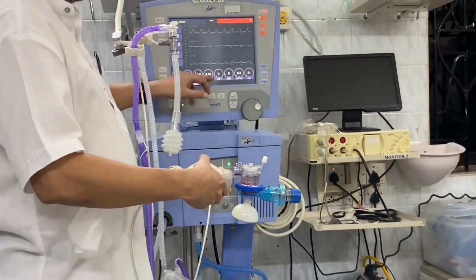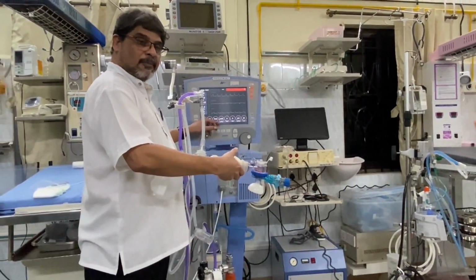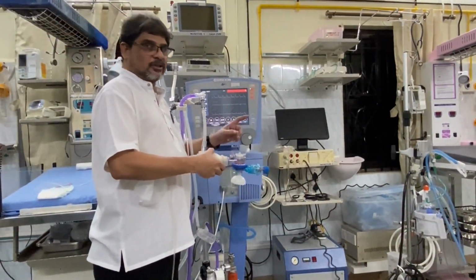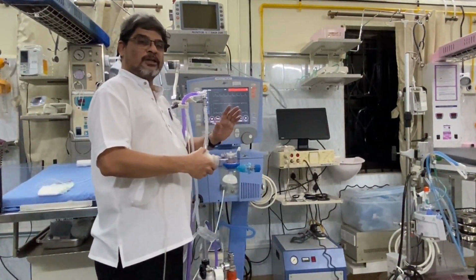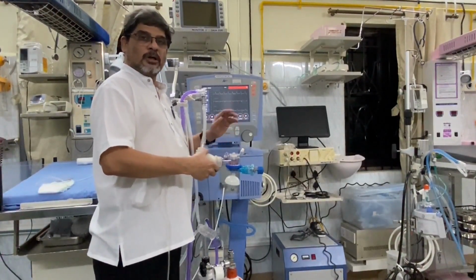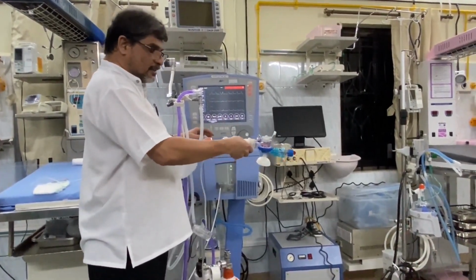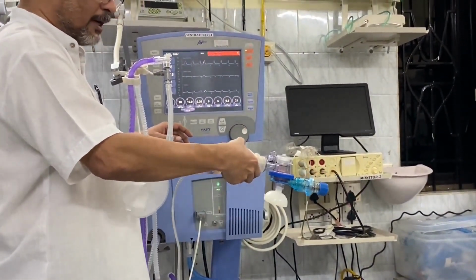So we have set the rate, we have set the inspiratory time, and then automatically the bag goes back and the baby goes into expiration. The ratio between inspiratory time and expiratory time is known as the IE ratio, the inspiratory-expiratory ratio. Normally in small babies we may keep 1:3, but in adults normally the ratio should be 1:2. So if the inspiration time is X, the expiratory time should be 2X. This is inspiration, this is expiration. The inspiration time is X, and expiratory time should take double that.